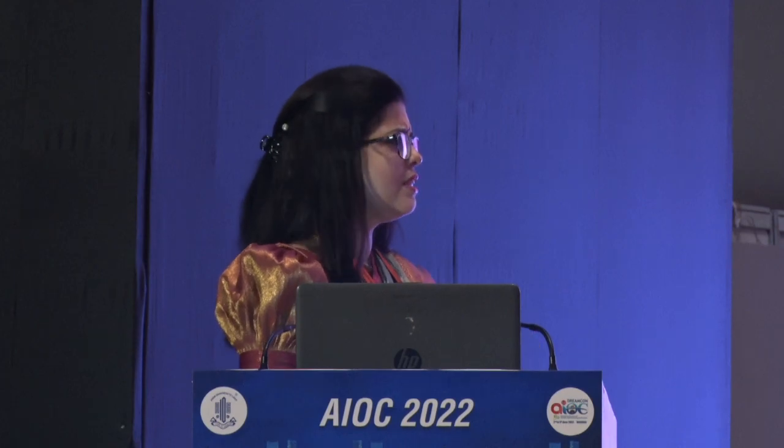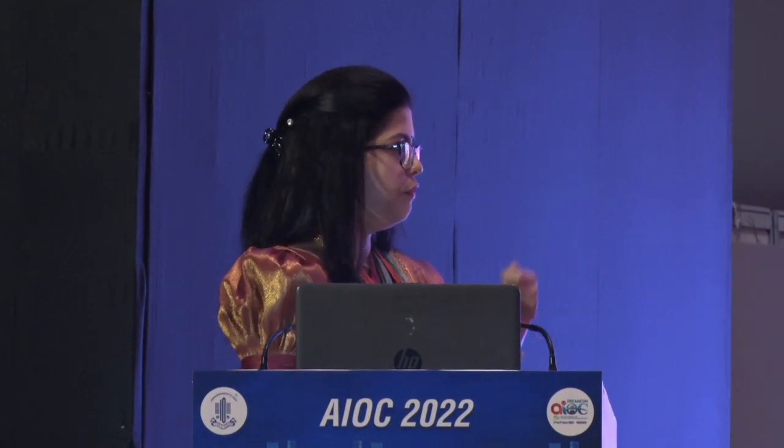So when we are tamponading, if the fluid is not getting drained through the peripheral open area of the DMD because it is fibrosed, it may end up not attaching the DMD, or sometimes even worsening the DMD, because there is no other area of least resistance. So that is the reason why we chose to do the simple maneuver, and we stroked the fluid out completely.